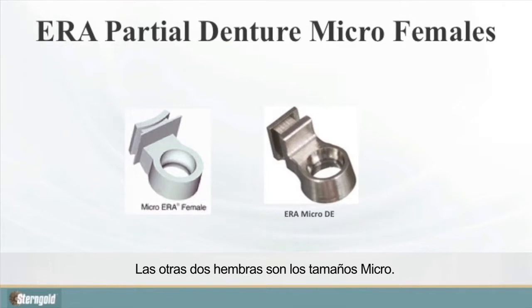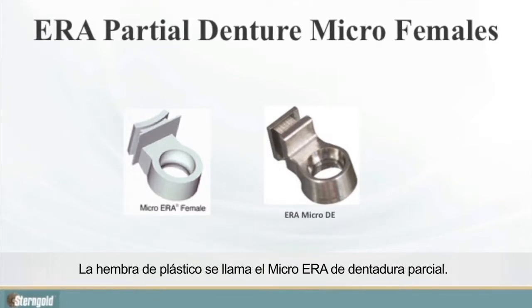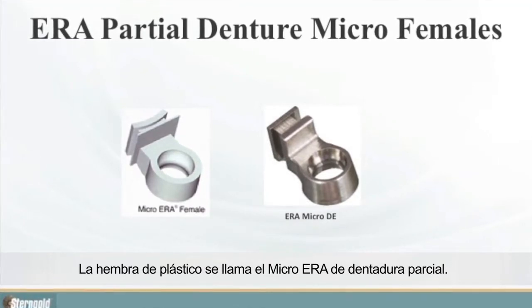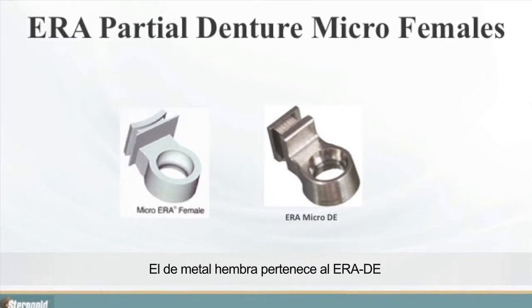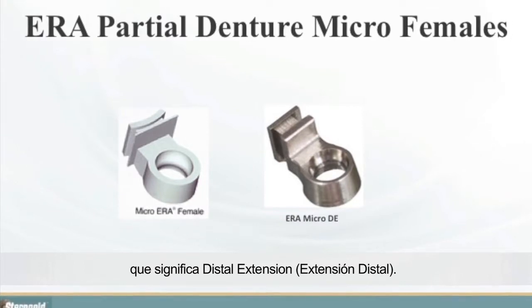The other 2 ERA partial denture females are the micro size. The micros are 20% smaller than the standard size. The one with the plastic pattern female is called the Micro ERA partial denture attachment. The metal female belongs to the ERA DE for distal extension.